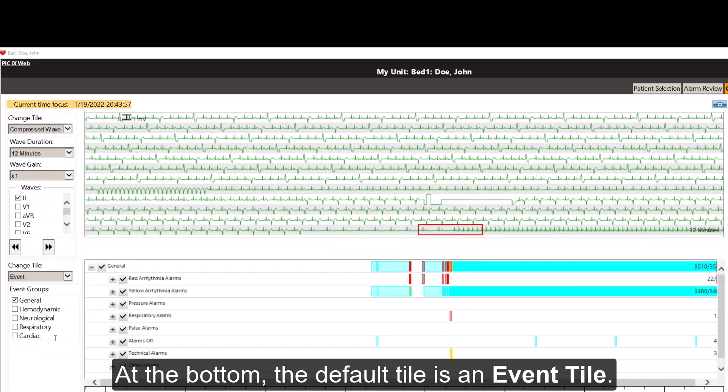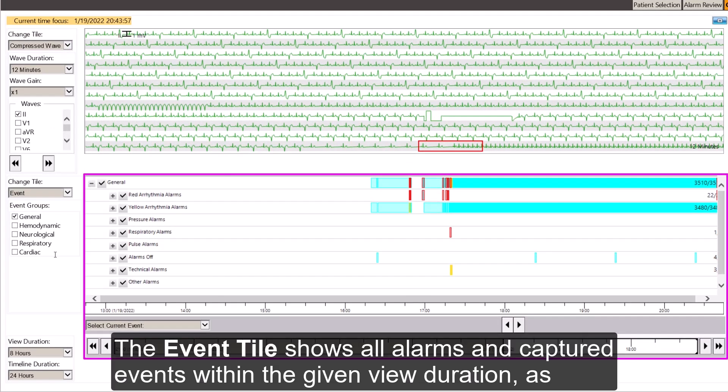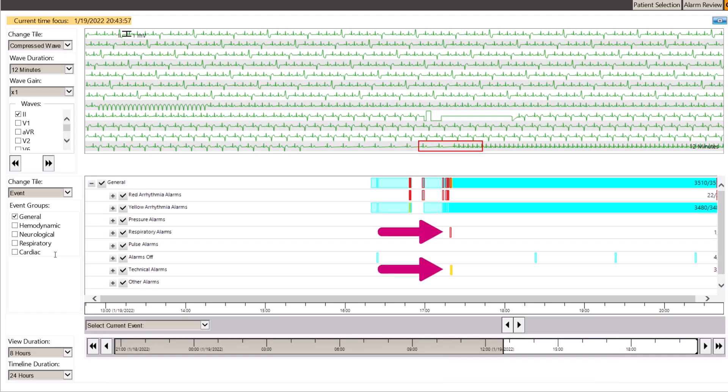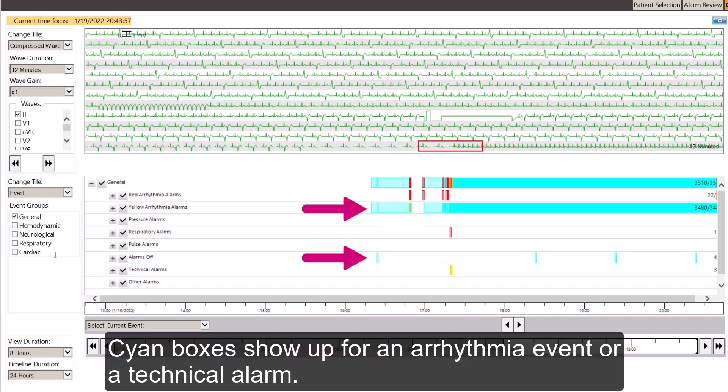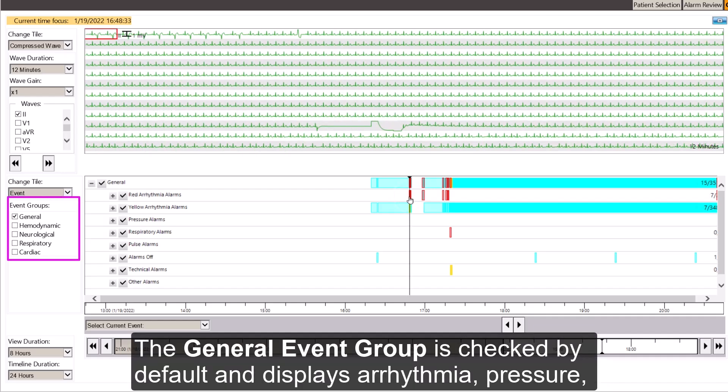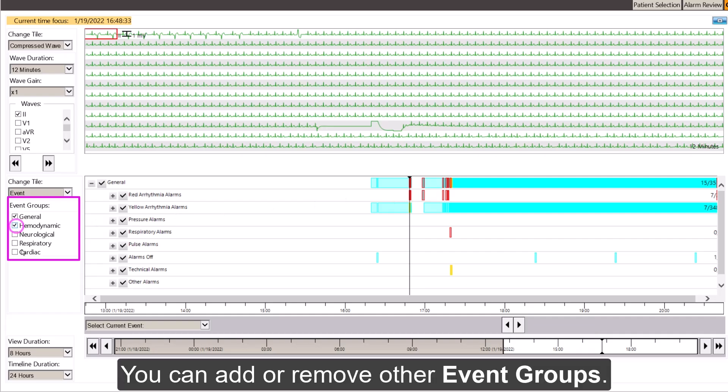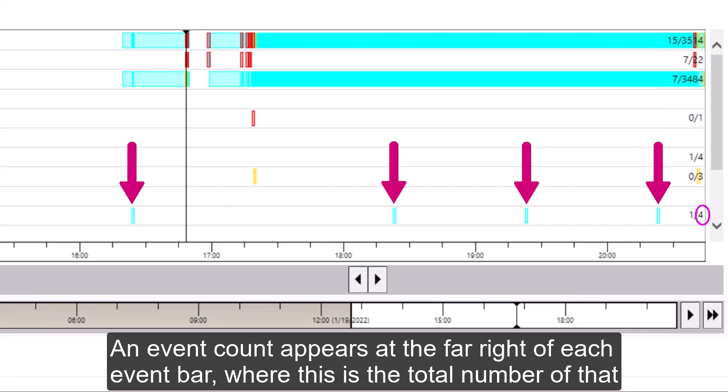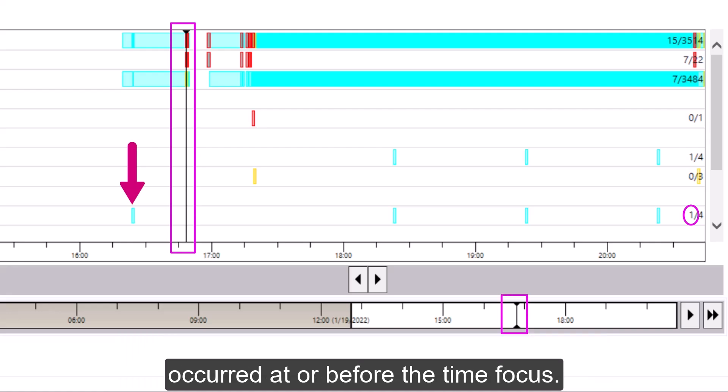At the bottom, the default tile is an event tile. The event tile shows all alarms and captured events within the given view duration as colored boxes. Red and yellow boxes represent a patient alarm. Cyan boxes show up for an arrhythmia event or a technical alarm. Click on any box to view the associated strip. The general event group is checked by default and displays arrhythmia, pressure, respiratory, and technical alarms. You can now add or remove other event groups. An event count appears at the far right of each event bar, where this is the total number of that type of event within the current view duration, and this is the number of those events that occurred at or before the time focus.